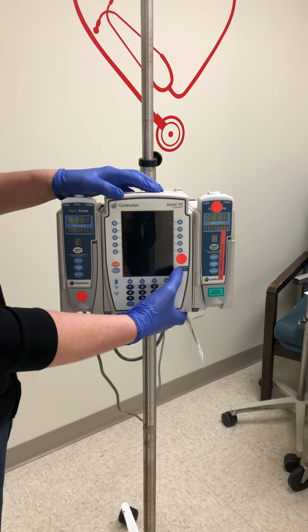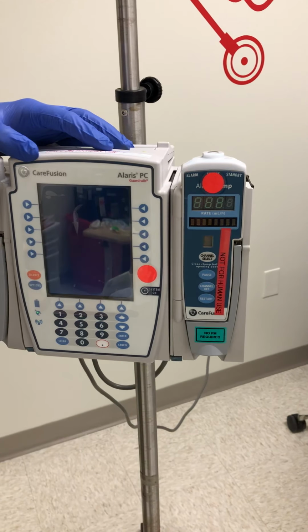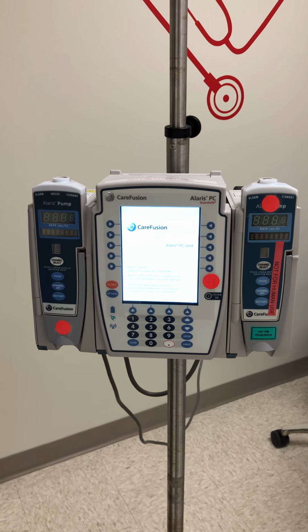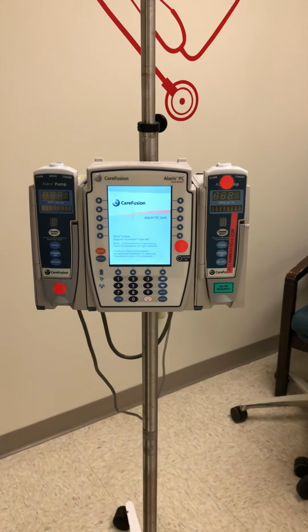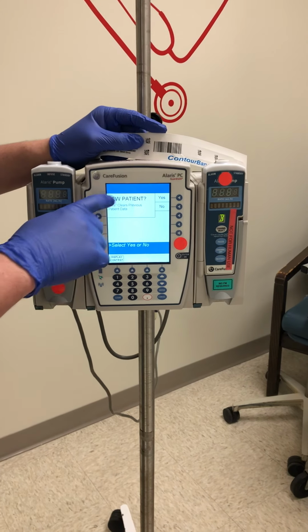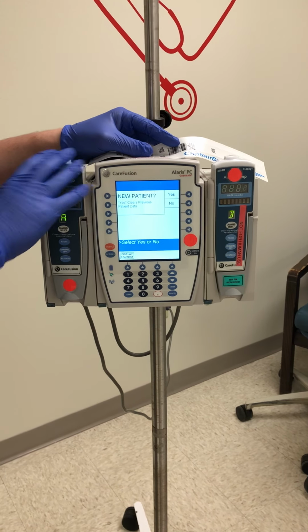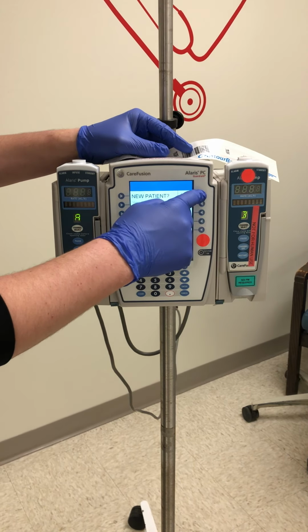So first thing you want to do is power on the IV pump where it says system on. Hold it for about a second and it'll start to boot up. First thing that you will see when you power on the IV pump is it's going to ask whether or not this is a new patient. So these IV pumps are programmed for each patient to make sure we're infusing the correct medications. You'll hear some beeps if you don't hit the buttons quickly enough. So what I'm going to do is hit select yes.